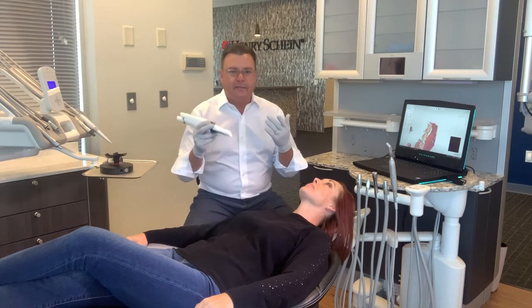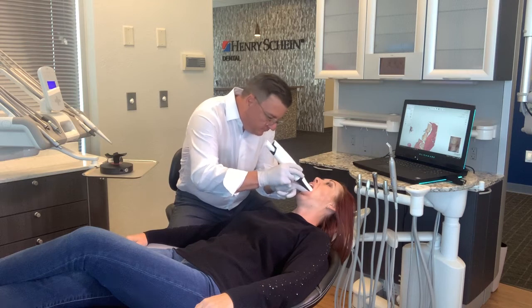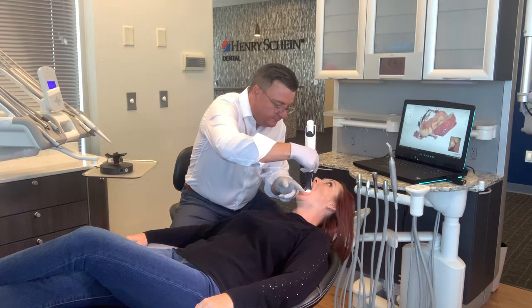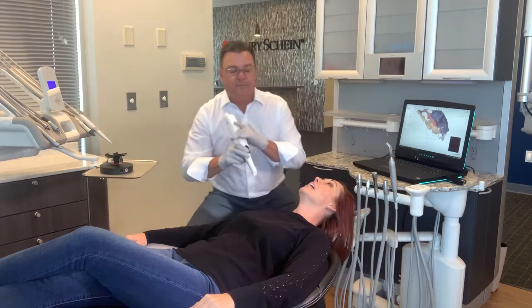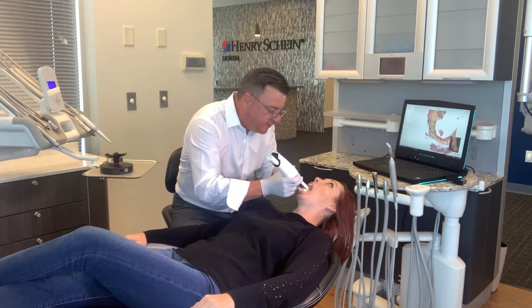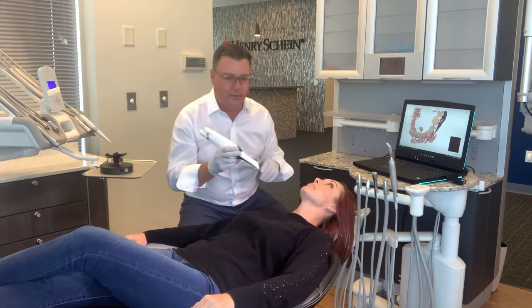One of the things you'll notice as I scan is I try and have my hands work together. One of the other things I'm doing right now is I'm trying to hide my retraction finger from the scanner itself, from the camera. That can sometimes interfere and cause the scanner to slow down. We really need to make sure that we complete the incisal edge and the whole occlusal surface before we roll too far buccal and lingual.